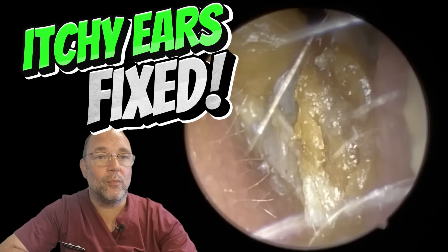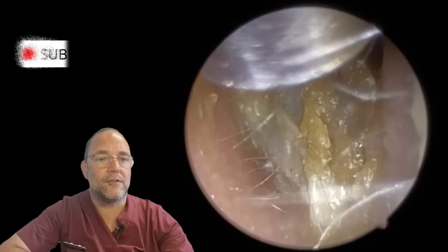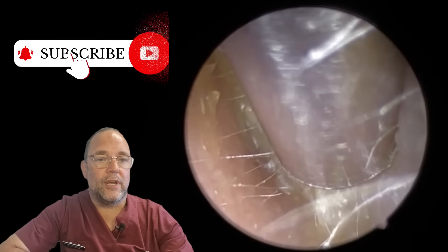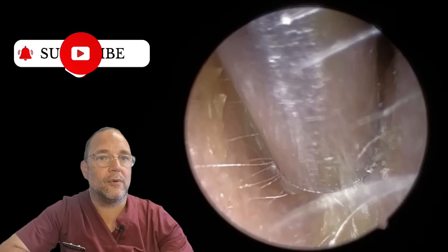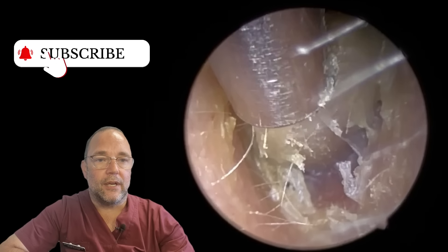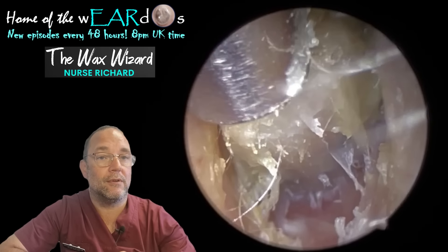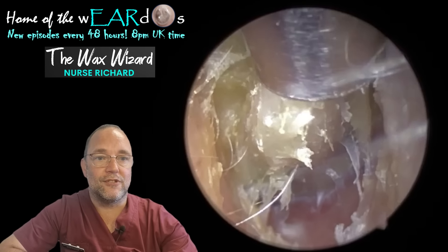Hello, good evening, good afternoon, good morning and welcome. It's Nurse Richard, the Wax Wizard. Thanks for joining me. Three goodies in this one today. The first one is a thick dead skin peel, which I know a lot of you like. And the second two from the same patient is just some big old chunky plugs that I managed to get a ruler shot for, for a change.